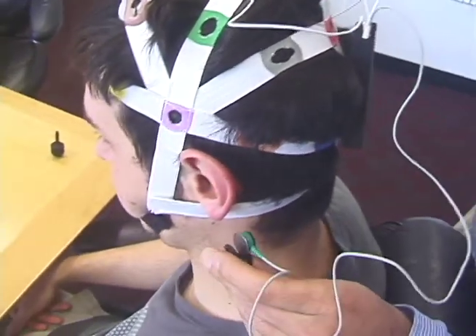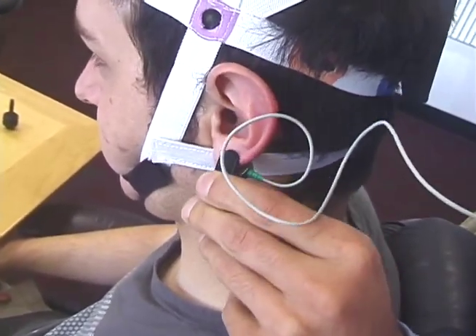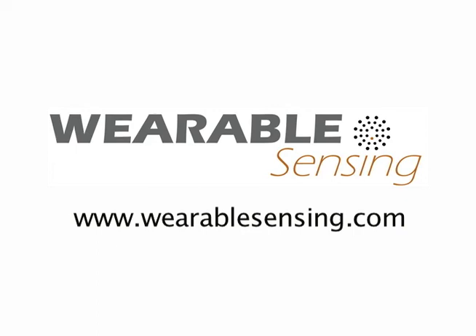Now, attach the ear clip electrode to the ear. Next, view the DSi setup video to verify signal quality before starting to record EEG signals.